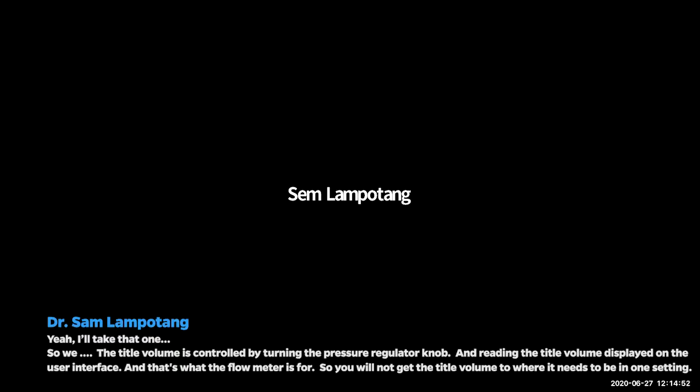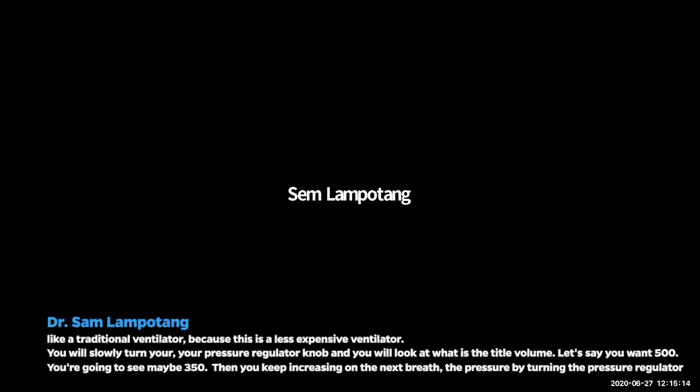So the tidal volume is controlled by turning the pressure regulator knob and reading the tidal volume displayed on the user interface. And that's what the flow meter is for. So you will not get the tidal volume to where it needs to be in one setting like a traditional ventilator, because this is a less expensive ventilator.